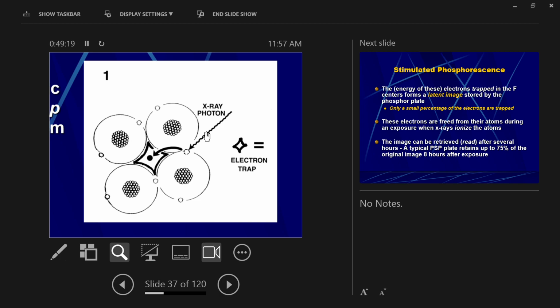But in these special materials, the electrons try to hop out of the atoms, and because of the molecular composition, because of the way those materials are put together, the electrons can't escape, okay? So they absorb an X-ray photon, they try to escape from the atom that they're in, and they get stuck. They get trapped, and that is literally what the word is, right?